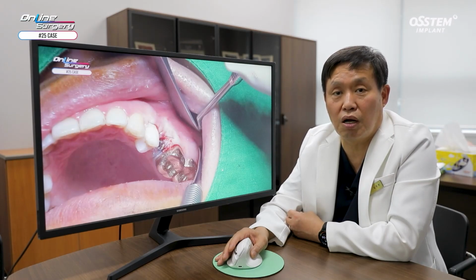Even when planning GBR or when connecting the healing abutment, you do not need to make an incision ahead. You can use a tissue punch and place the implant. After that, you can reflect the flap in a minor way and do intra-socket graft to get good results.